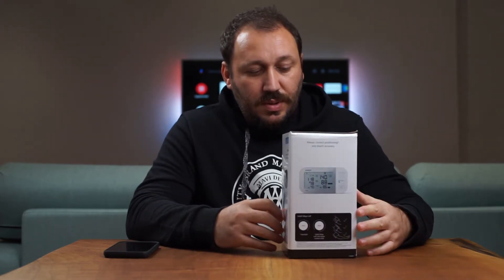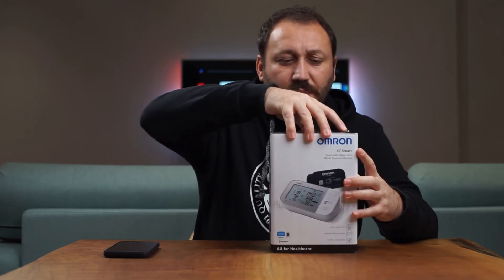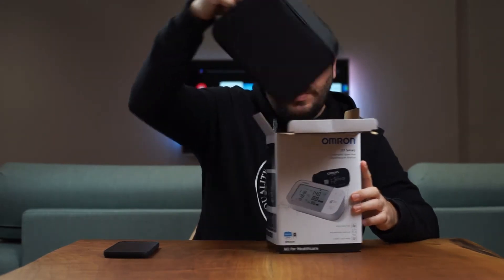This device comes with a two-reading screen and it's also smart. When you use the Omron Bluetooth application, it synchronizes after every measurement via Bluetooth. I'm going to do an unboxing — I'll just simulate it with the one I already opened.